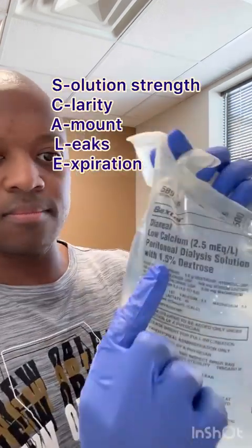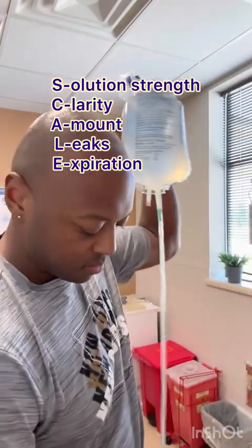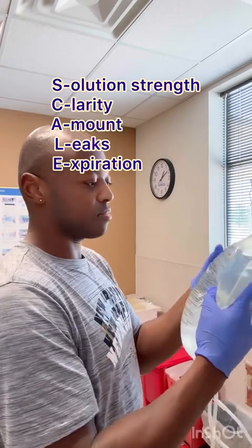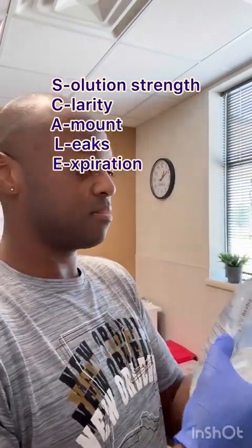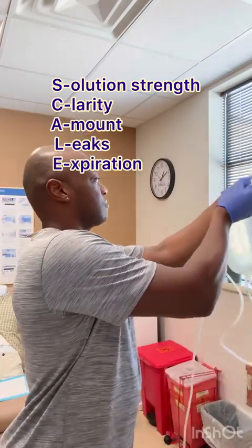Look at the scale, look at the solution strength — check three places. That's 1.5, and it's yellow, 1.5. Make sure it's clear with nothing floating inside. Make sure it's the right amount — 2.5 liters. Squeeze it to make sure there are no leaks, and check that expiration date.